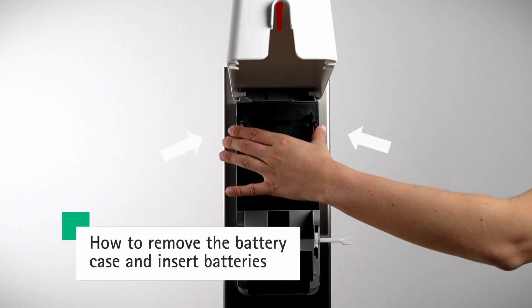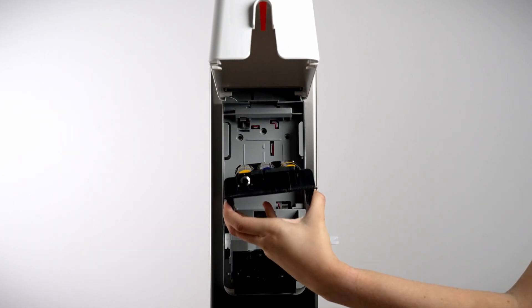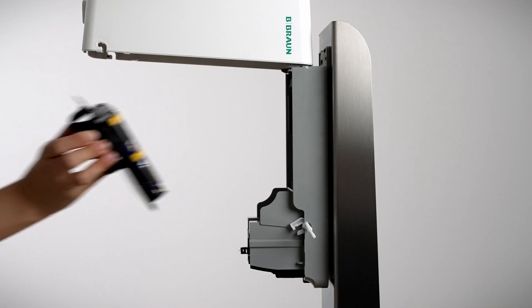To change the batteries, simply remove the battery case by gently pressing the black tabs on either side — left and right — inward and toward you at the same time.